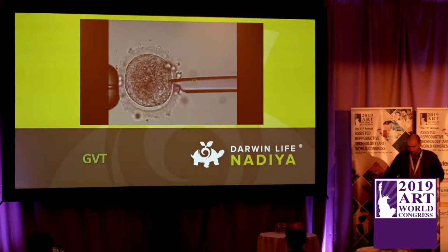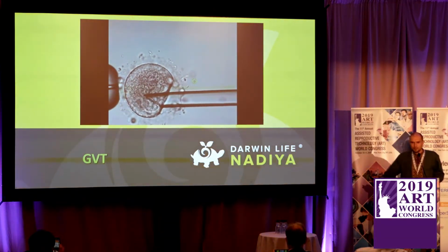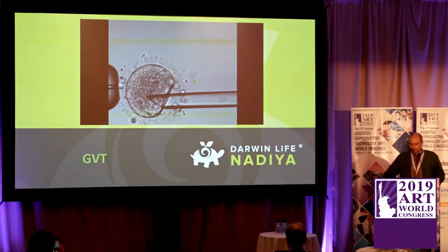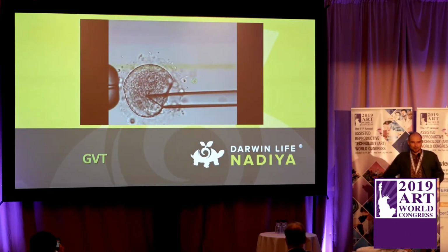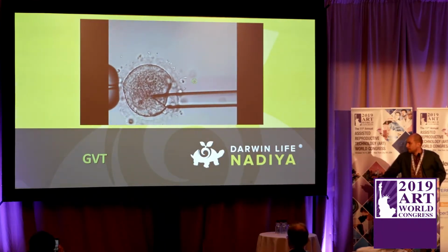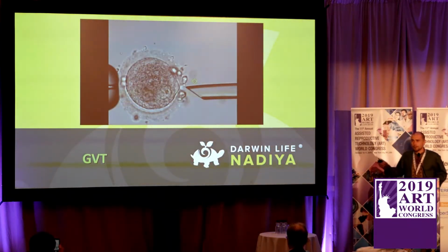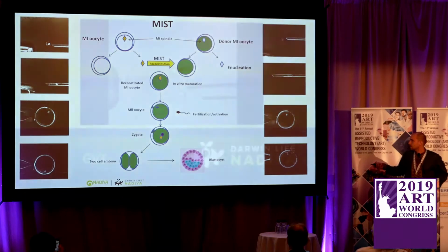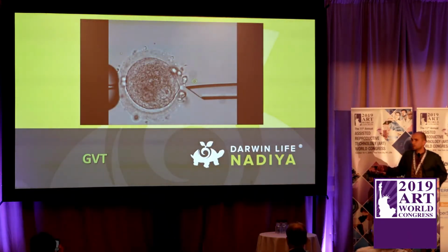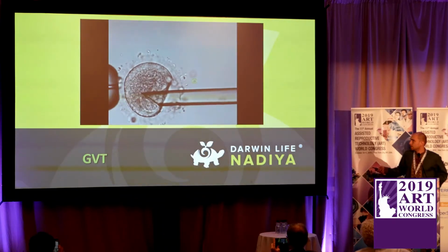So the first video. Then we'll move much faster. The same basic scheme, some videos, but everything the same. So now we are removing the, oh, sorry. Can you play it again? No, back. Can you play the video? Okay, thanks. So, removing the nucleus from the patient's GV.